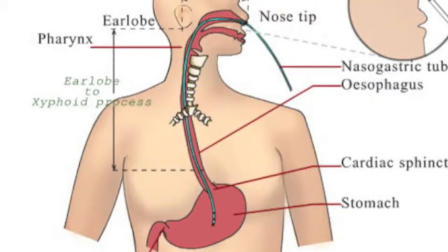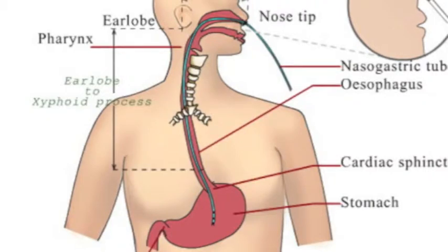You have seen maybe these types of tubes in the hospital. Little blue pigtail called a Salem sump, and I'll explain that. There are other types of tubes which are for feeding, enteral feeding. But today we're going relative to the different purposes of NG insertion. Decompression, that's removing gastric secretions, which is a therapeutic process for the patient.